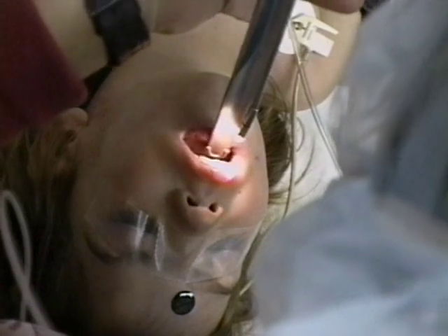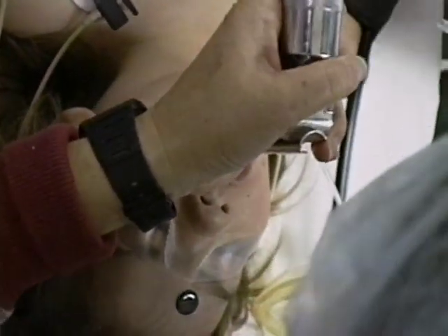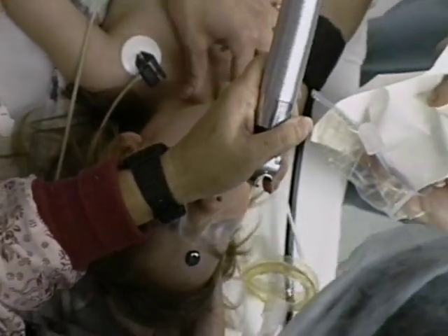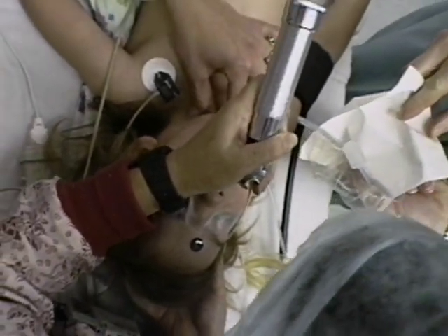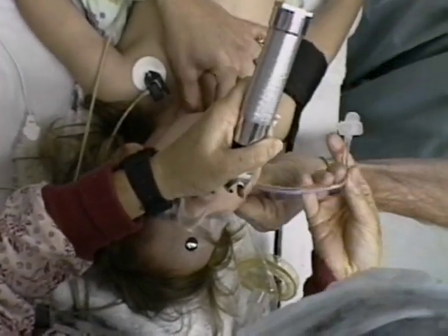Although you can intubate an infant or toddler with a larger blade, it's technically much more difficult. The larger blade often interferes with visualization and gets in the way of passing the tube. It also carries greater risk of injuring the oropharynx.